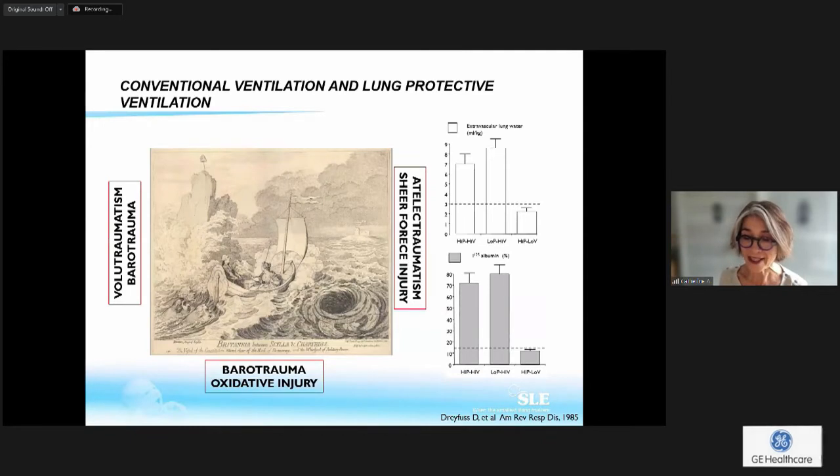So it's a tricky thing, because when we ventilate the patients, we have to avoid different things. The first thing that you have to avoid is atelectrauma. What is it? Whenever you increase the pressure, when you have a collapsed lung, you might have some alveoli which open up at a certain level of pressure.